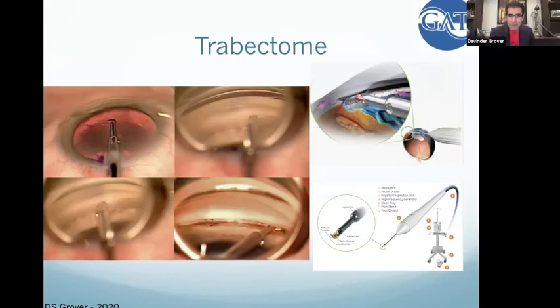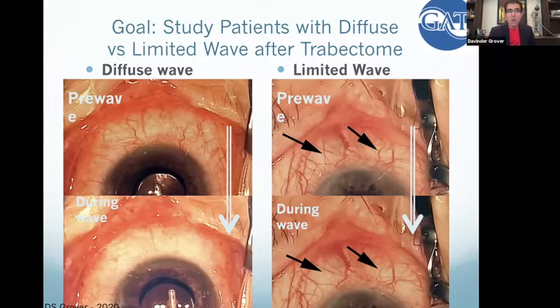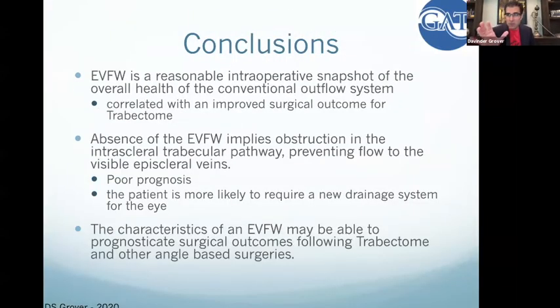Yeah. So let's go back. Very good questions. I love this. In conclusion, the episcleral venous fluid wave, as we've been talking about, I think is a really good intraoperative snapshot of the overall health of the patient's outflow system. I think patients that have a great wave have a good prognostic indicator, and patients that have a poor wave tend not to do as well. And I think we can use that as a prognostic indicator.